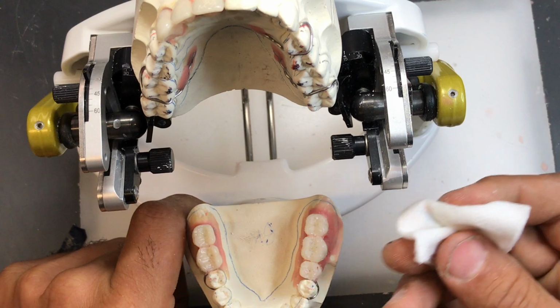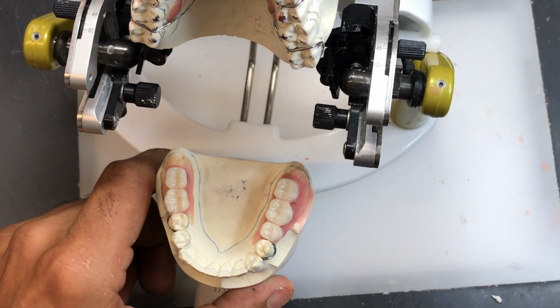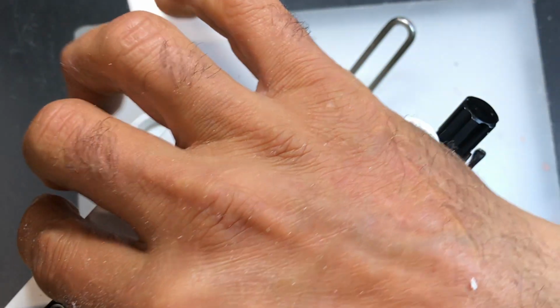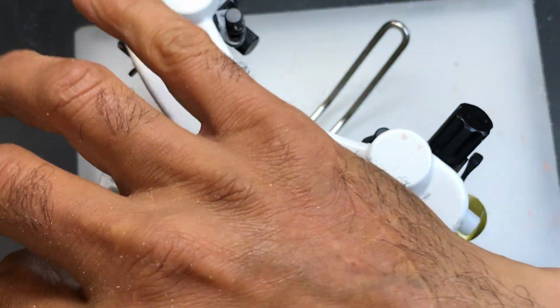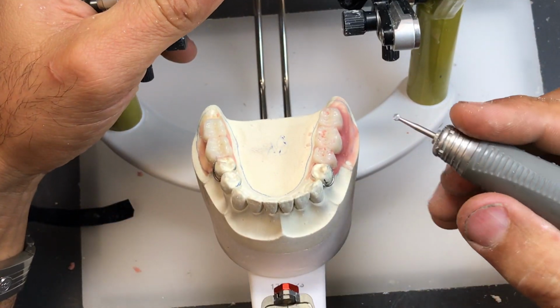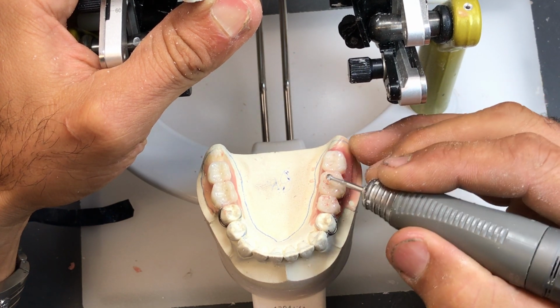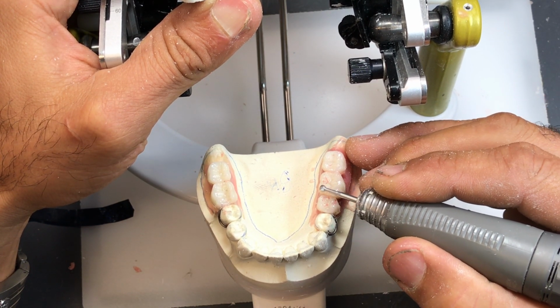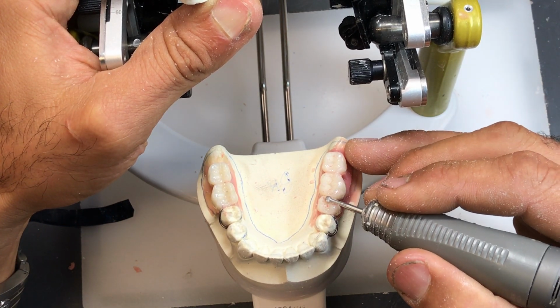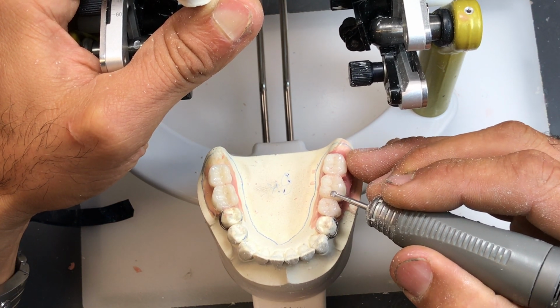You can always use just a piece of gauze with a little bit of wax remover on it, just to clean off any of the articulating paper imprint. And I'm getting close now. I can feel the bite coming a little bit closer together. Don't just spot grind, but more like a bowl effect. Trying to round off any grinding that you do.